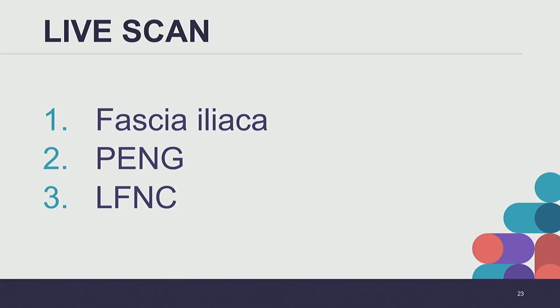And then we'll quickly go over the femoral nerve as well. So we can drop the depth a little bit.